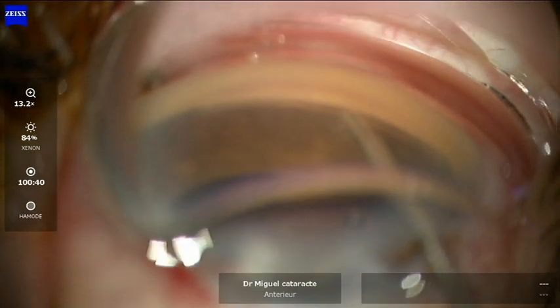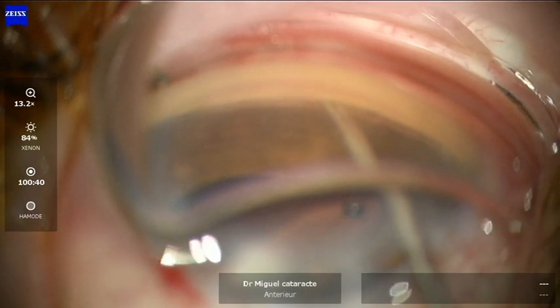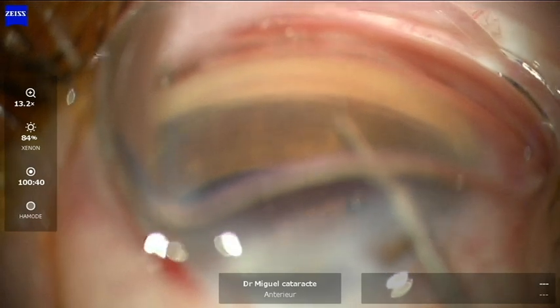Then approximately at two o'clock hours of distance, we put the second iStent W of the second generation and we slowly retreat.